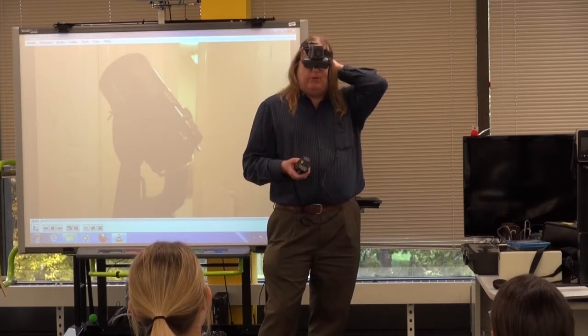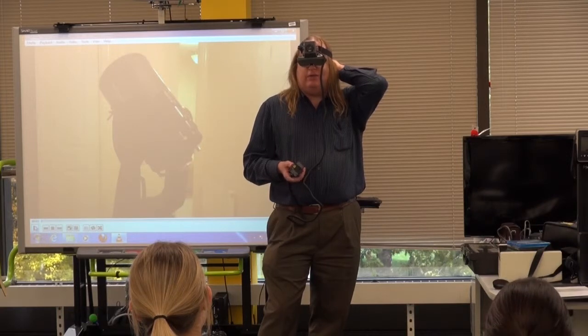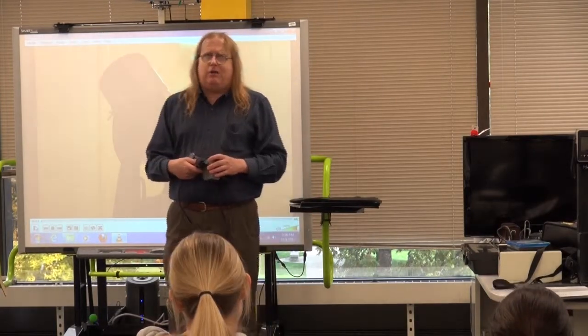Now, the important thing to remember when you're using this is I can see things at a very great distance, but I can't see things right under my feet. So if you use a device like this, you don't want to be walking around with it. You see, some people think, oh, well, the blind people, if they had this, they wouldn't need the cane and the dog anymore. No! You use them all, guys.